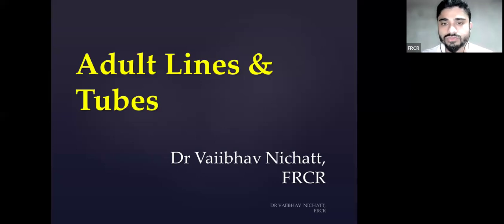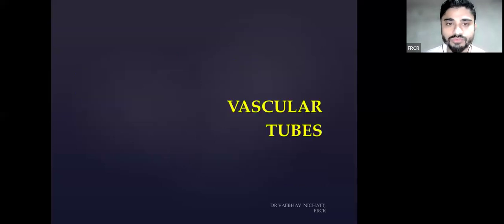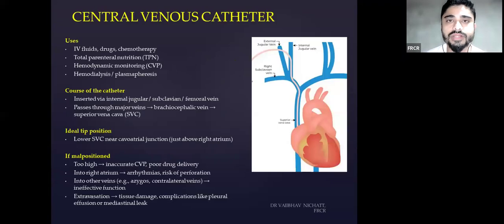Okay, so the first and foremost thing that should come to our mind is central venous catheter. So uses of central venous catheter is for IV fluids delivery, drugs delivery, for chemotherapy agents, also for total parenteral nutrition, for hemodynamic monitoring, also for hemodialysis and plasmapheresis.